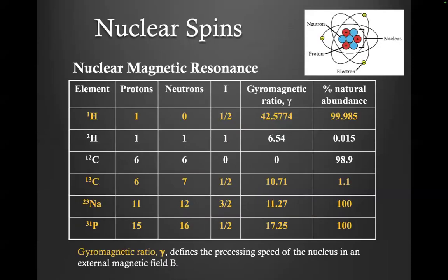For MRI, we are imaging nuclear spins. These nuclei have protons, neutrons, and electrons, and these little spins are very abundant in the natural environment. There are different kinds of elements, and everything in yellow can actually produce MRI signal. But we will be focusing on hydrogen, which is very abundant. Your body is full of hydrogen from water, tissue water, and everything.